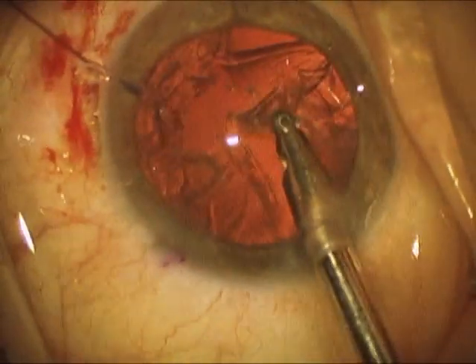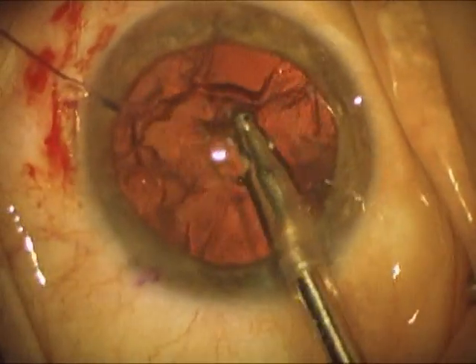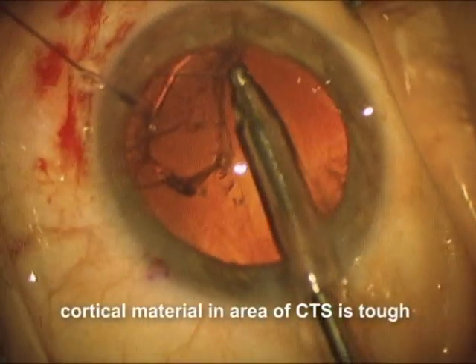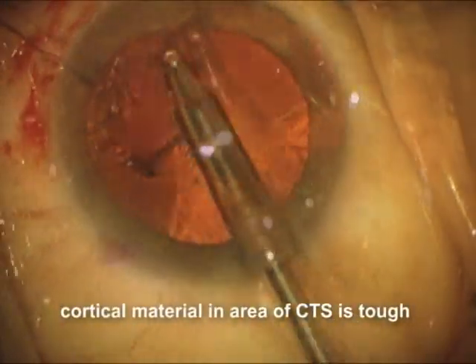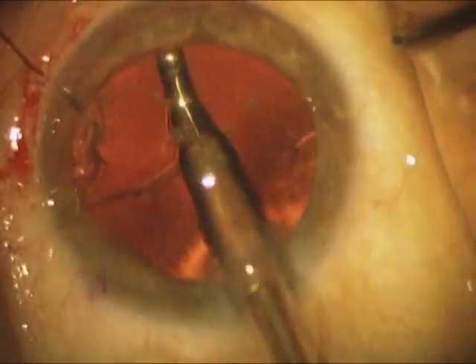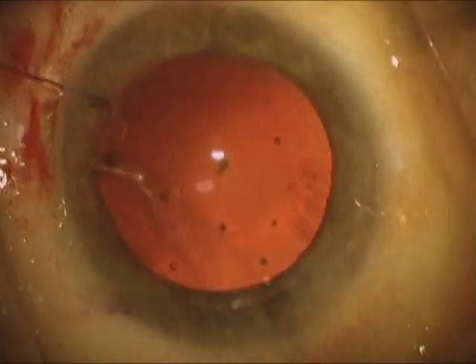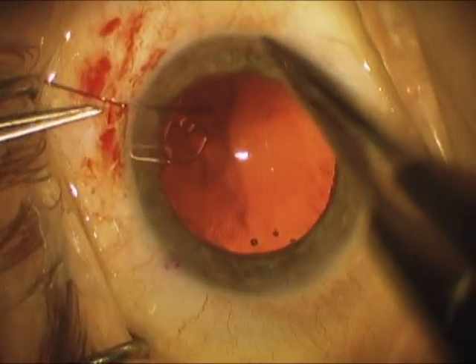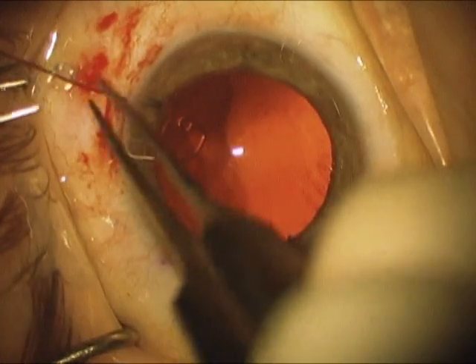The cortical material comes out nicely, except for the area where the capsular tension segment is. Here I probably should have loosened the segment a bit, but you can see eventually we get the cortical material by moving it around the capsular tension segment. Now we have an empty capsular bag, and we're going to loosen up the hook and remove it.